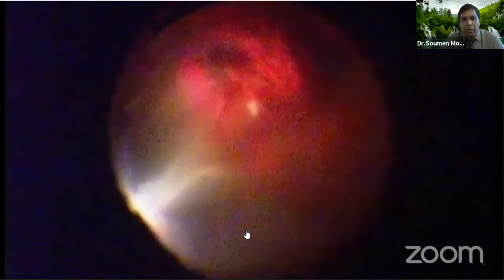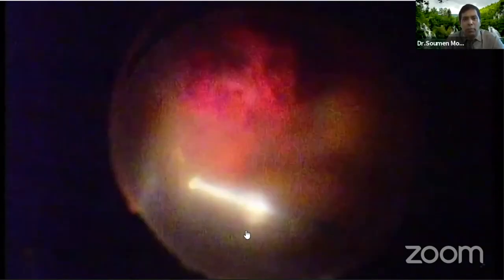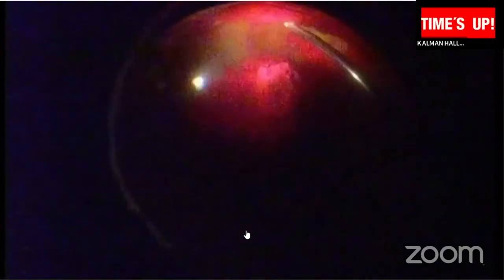Vitrectomy is done, clearing the vitreous hemorrhage. Now we can see a blob of clotted blood, which will actually guide us to the region where the foreign body is impacted.